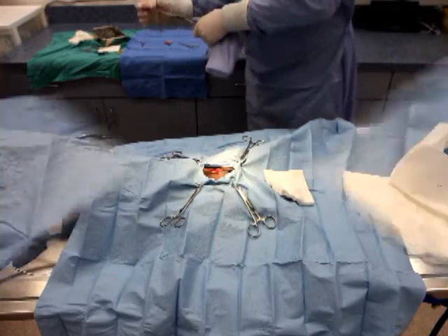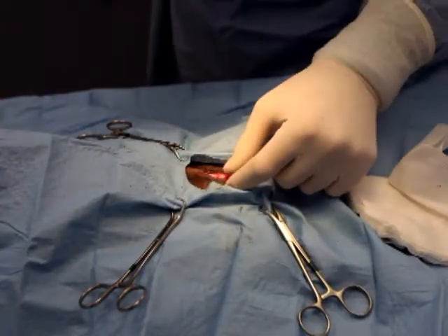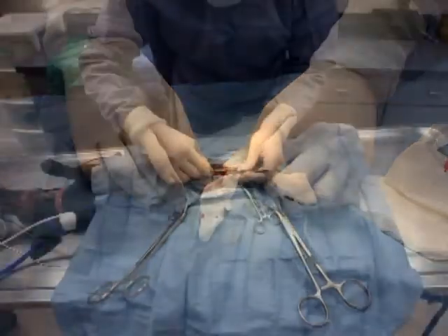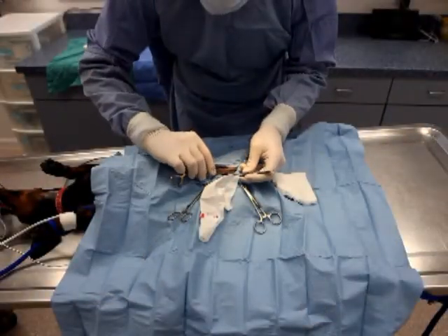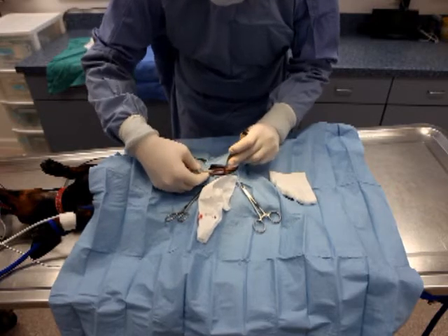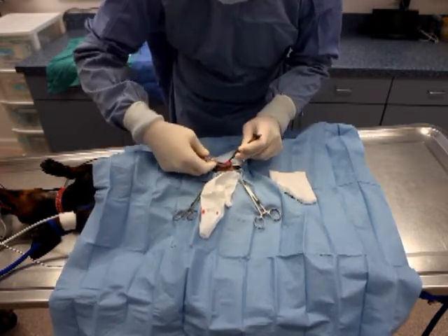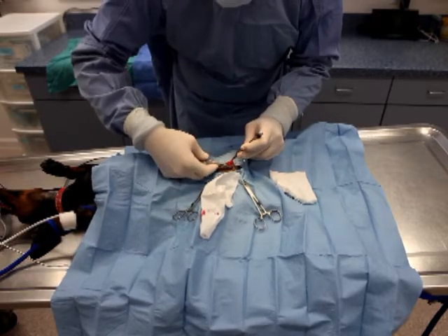After the castration is complete, inspect for any signs of excessive hemorrhage. As you will see from the video, the only source of hemorrhage is the skin incision. For completing the procedure, go ahead and close the incision with a simple continuous two-layer closure.